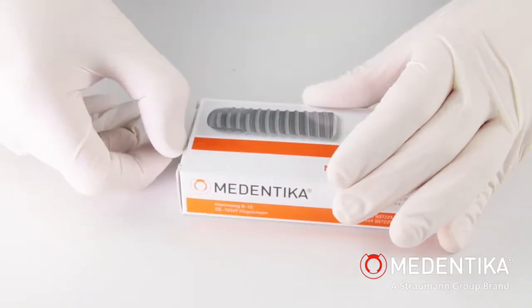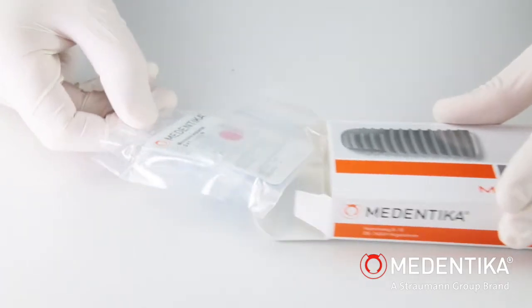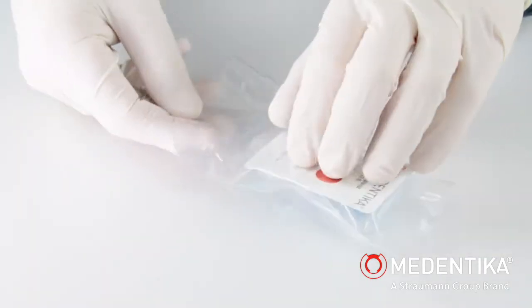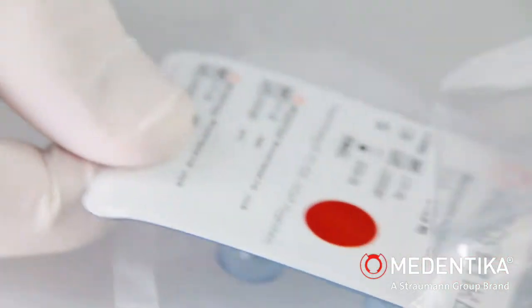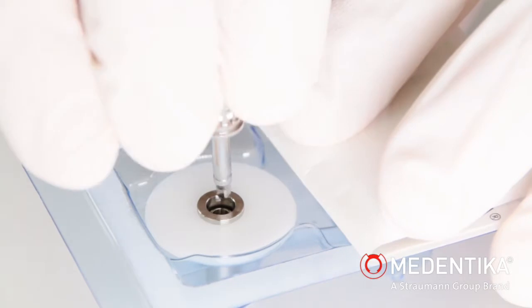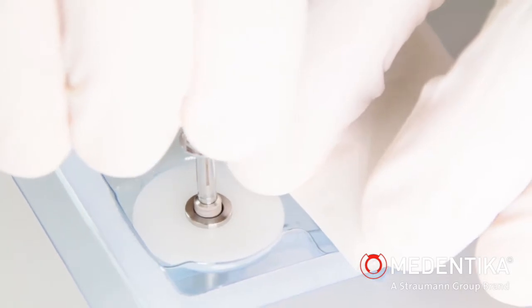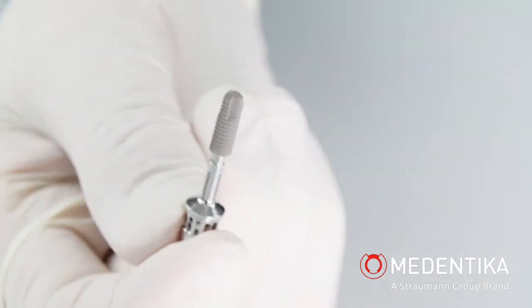The implant is supplied in a sterile blister pack. A sterile blister pack is removed from the peel bag. The dual removable seal label is removed to access the implant. The placement instrument is inserted into the implant connection geometry as far as it will go, then turned clockwise until the square slides into the corresponding square of the implant. The implant secured on the placement instrument is then removed from the titanium tube.